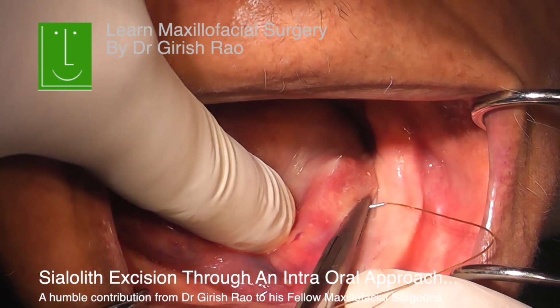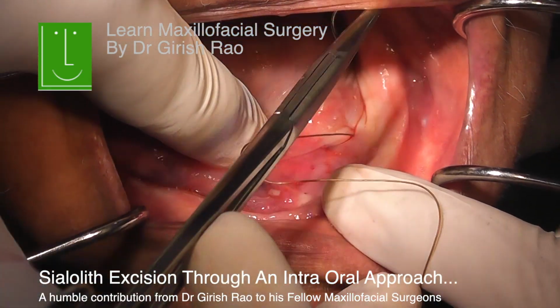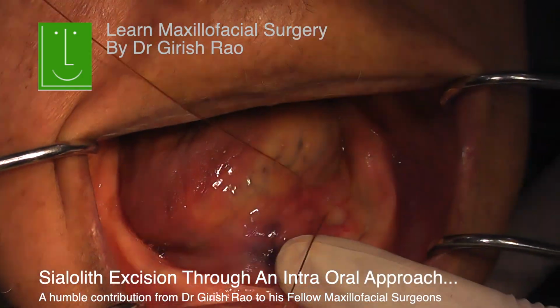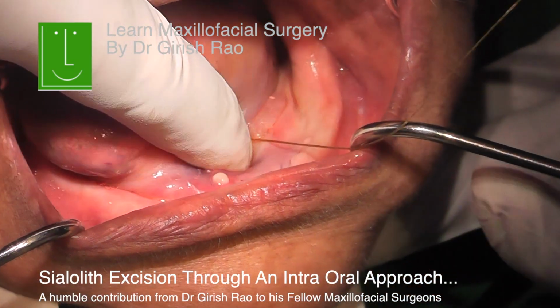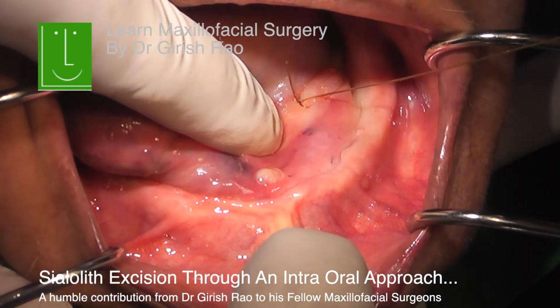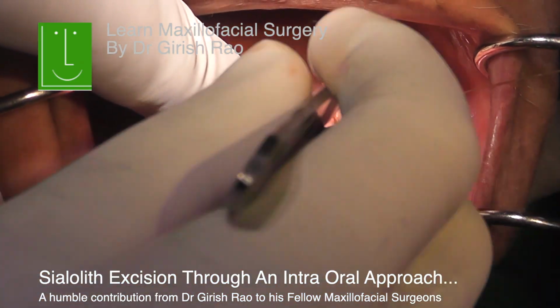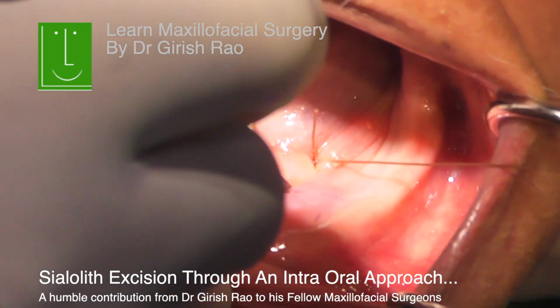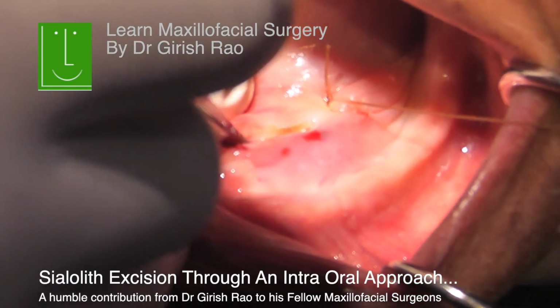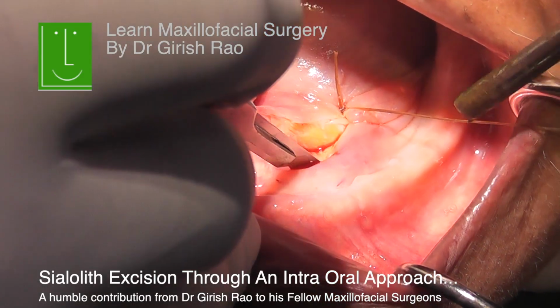Before you do the surgical procedure, it's a good idea to take a stay stitch behind the palpable stone, and basically this is to prevent the salivary stone from slipping back. Many times when you're dissecting, it can go back, because the duct would have become dilated, and because of the force of the saliva, the stone would have been pushed almost to the anterior part of the floor of the mouth. So it's a good idea to put this stitch, and it also helps in elevating the floor and giving a bit of traction when you are doing the surgery.